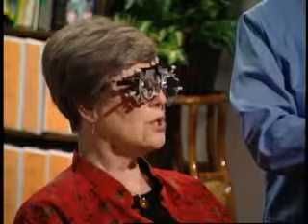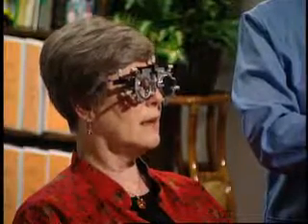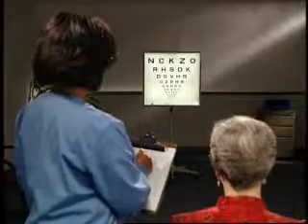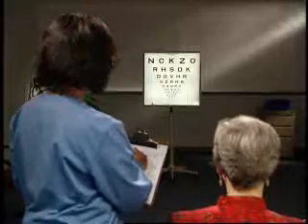Since the examiners will be busy circling the letters a subject reads correctly on the CRF worksheet, it is important to encourage subjects to read slowly, approximately 1 letter per second. D, O, V, H, R, C, Z. Ms. Burt, please slow down. Remember, approximately 1 letter per second. Please continue. R, H, S, O, N.